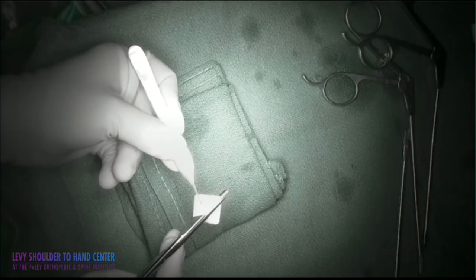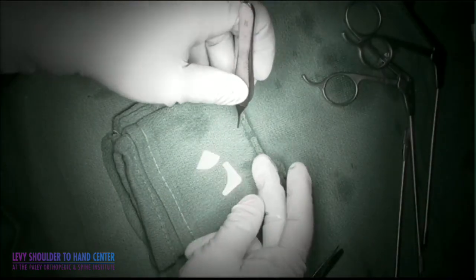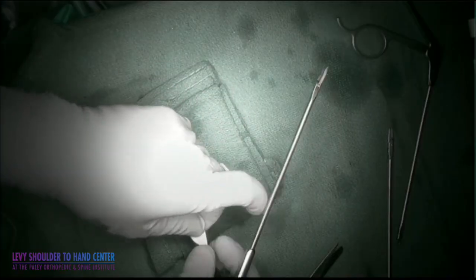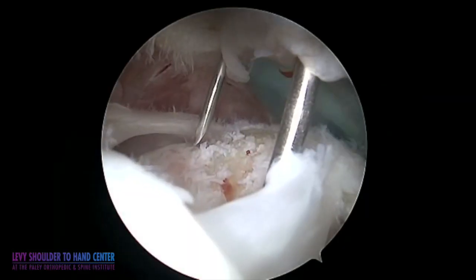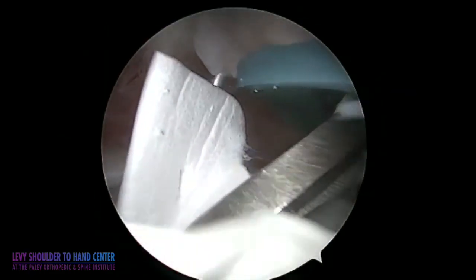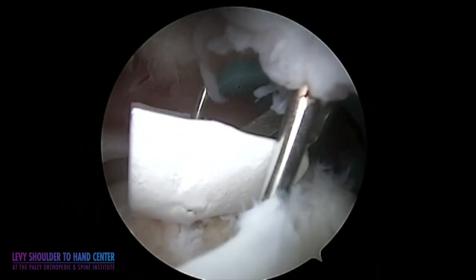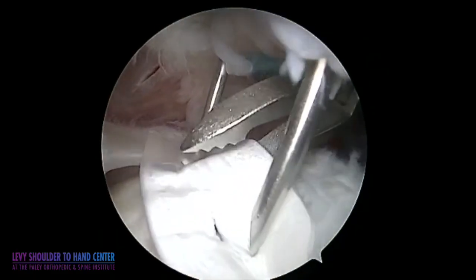The patch can be fashioned to match the footprint, as patients have different footprints. They're different size patients, and this particular patient was a bit smaller. I cut it to size, and then I insert it through a lateral cannula. Two spinal needles are placed where the anchors will eventually be placed. The graft is advanced to the footprint. The footprint has previously been prepared with a shaver to create a bleeding surface, and each of the two spinal needles is used to just hold down the graft in place.